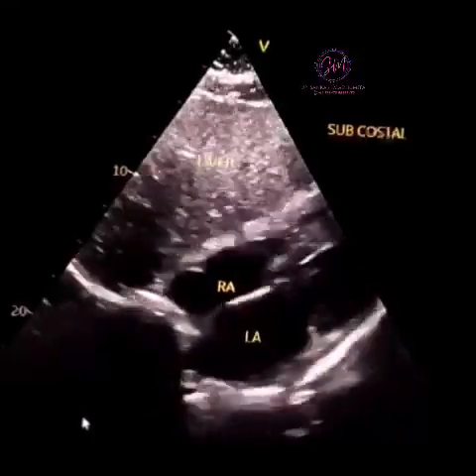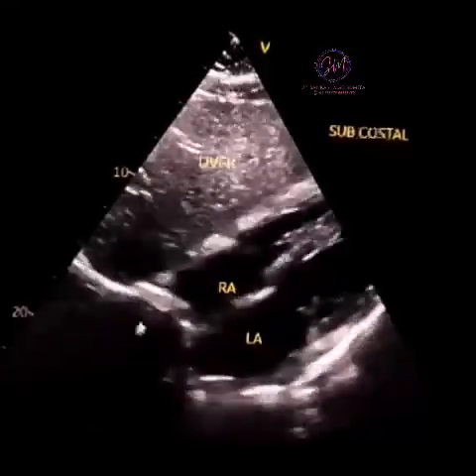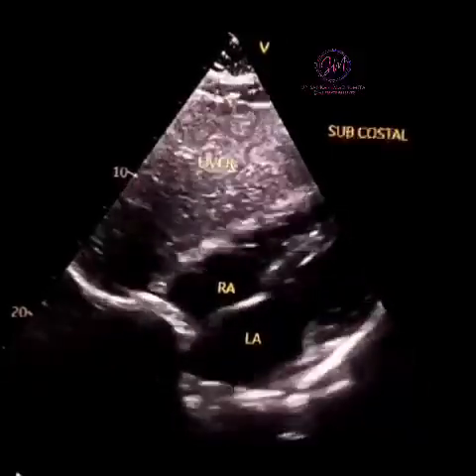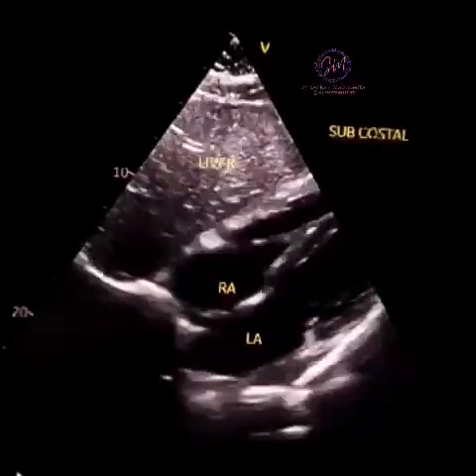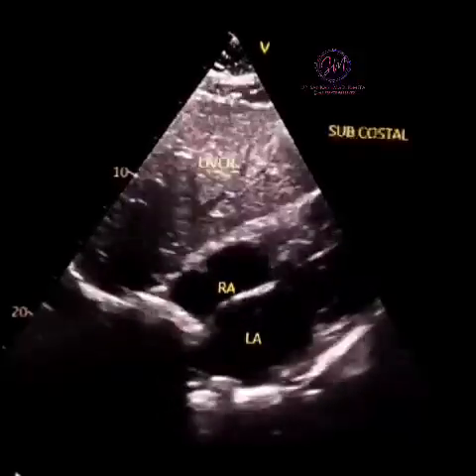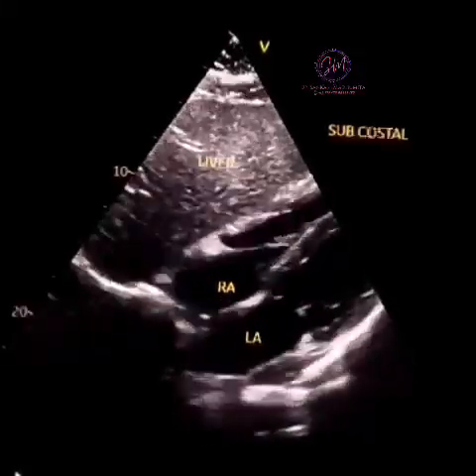Let's go quickly to the subcostal view and visualize that there is no atrial septal dropout actually in this case, which can be confirmed by color Doppler as well. But here we are going to do something more. We are going to push air bubble contrast in the left hand, the left cubital vein, because it's the left superior vena cava we want to visualize, and it is going to the coronary sinus.